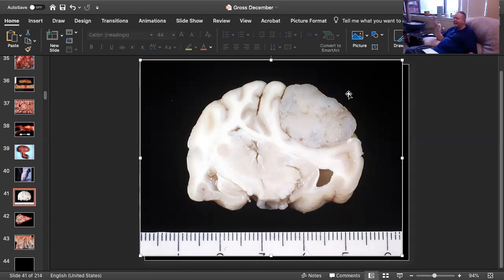Meningioma in cats, they tend not to infiltrate. Big meningiomas in dogs may infiltrate the underlying tissue, which makes it very difficult to excise completely. In cats, you can usually shell them out, but when you wait this long, I don't think that cat's going to do very well.